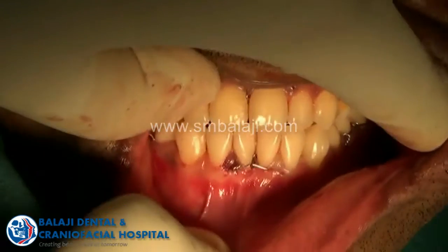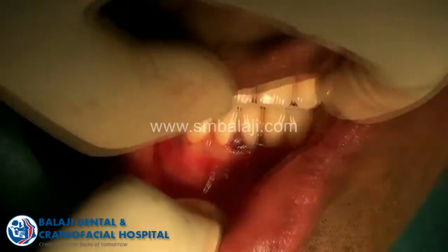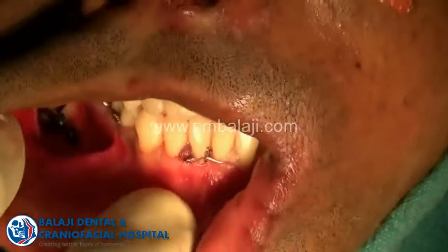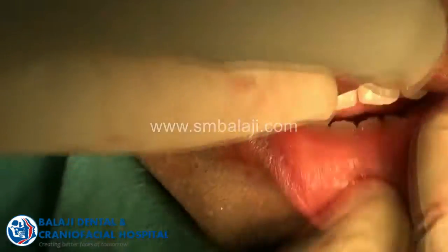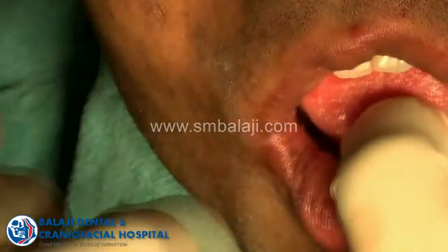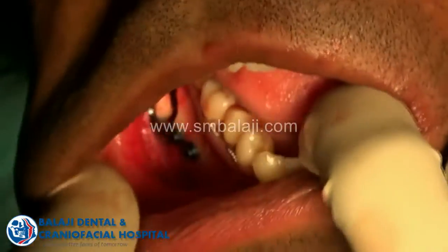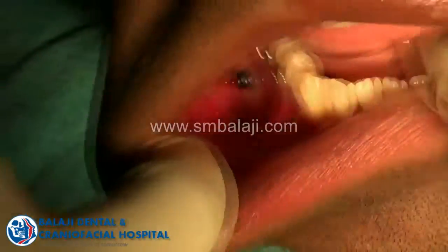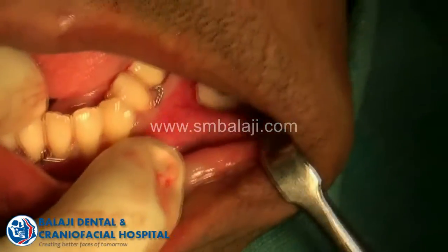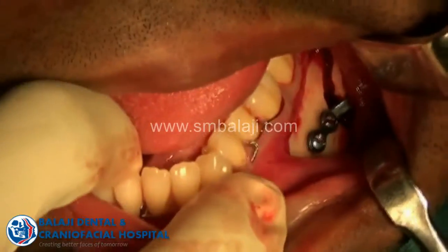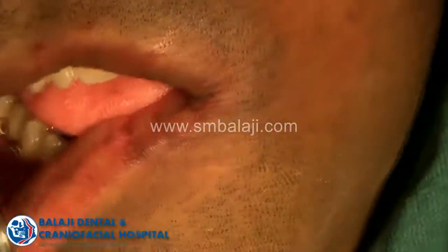Once the mandible is repositioned, you can see the post-operative occlusion. I don't do intermaxillary wiring if the occlusion comes perfectly well. You can see the plates which are fixed on either side. This procedure is also used for advancement.